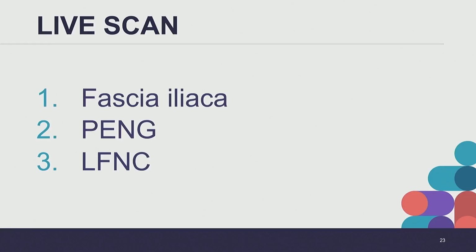All right, any questions about those? Yes, sir. Can we go back to the fascia iliaca block and show where the needle should be? Yeah. We're going to go back to the suprainguinal fascia iliaca, and we're going to demonstrate where the needle stick should be.